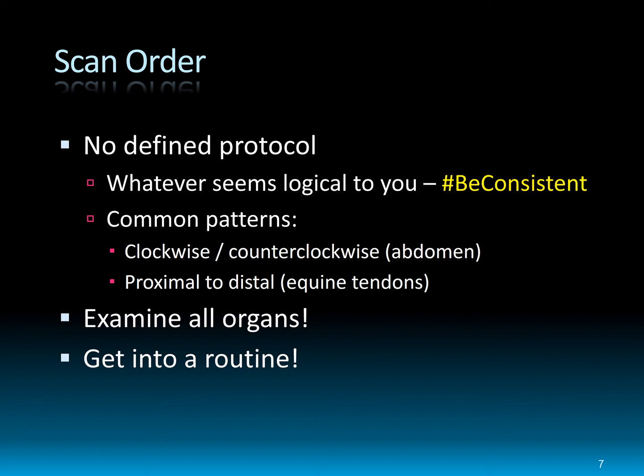There are various patterns that people tend to use. A lot of people start with either the cranial abdomen or the caudal abdomen and then go either clockwise or counterclockwise. Again, it depends on what you like. If you're doing musculoskeletal work, a lot of people go proximal to distal, but if you like distal to proximal, that works too. Really, the most important thing is that you look at everything and get into a routine so you don't miss anything along the way.